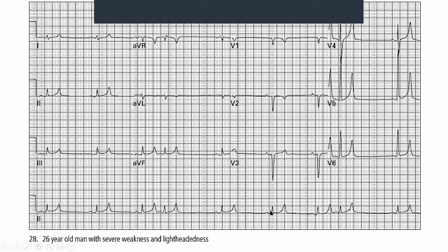So this is a sinus bradycardia. So how bad? Well, actually, sorry, my apologies. Not a sinus bradycardia. The groupings are not regular. We've got occasional premature ventricular contractions, which is what's happening here. If there's a little P wave in front of those, which may be here, then you could say it's a premature atrial contraction as well.